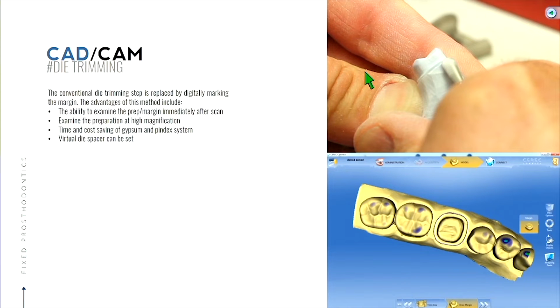So yeah, let's go through the advantages of this digital method. One is the ability to examine the prep immediately after the scan. So once you've scanned it, you can blow it up real big. Right? And we have all these tools to analyze this prep. If you were going to do that the analog method, guess what you have to do? You'd have to pour that up in stone, wait for that to set, and then look at it under a microscope. So you're probably not going to do that mid-preparation or mid-appointment. However, in this digital world, we have the ability to do so. Okay, so that's a pretty big advantage, that you can analyze your preparations in real time.